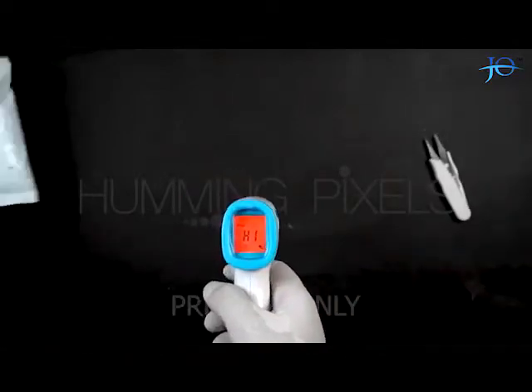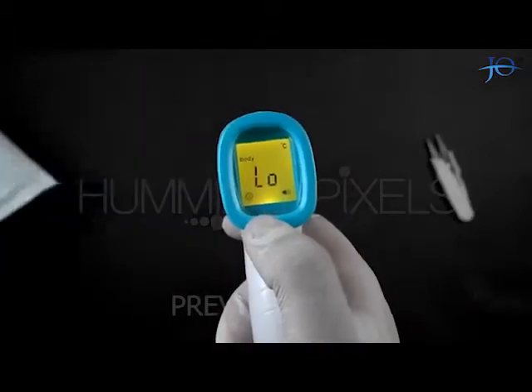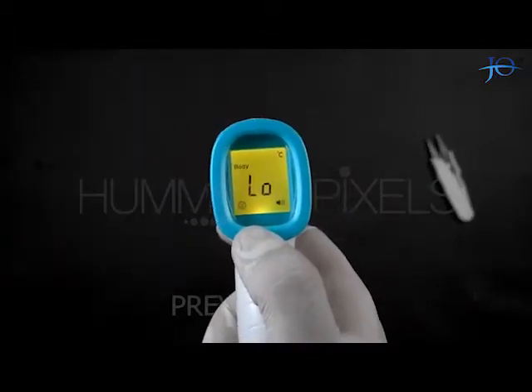Now we will again use the ice pack and see how the temperature gun reacts to low temperature. It is now showing us a yellow light along with the temperature warning 'Low'.